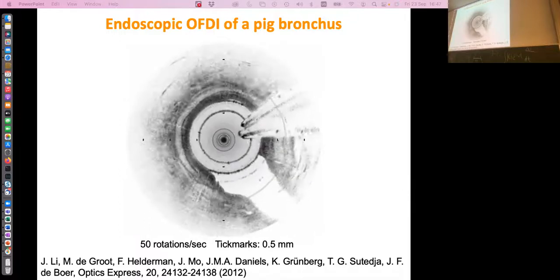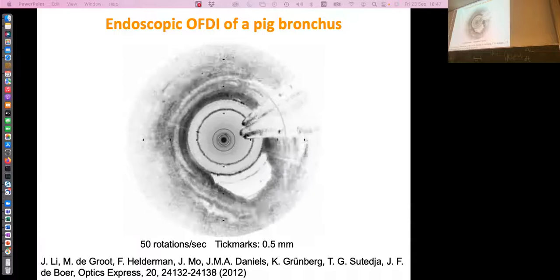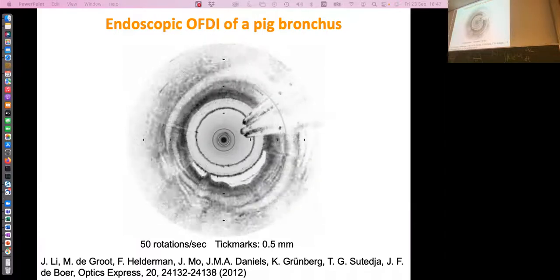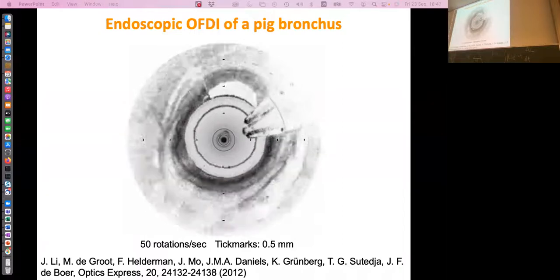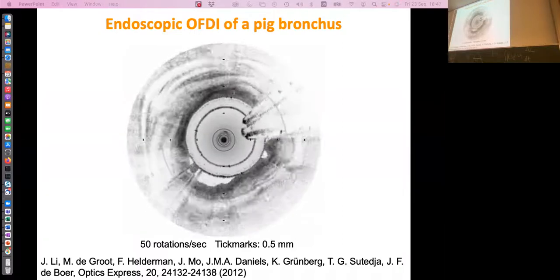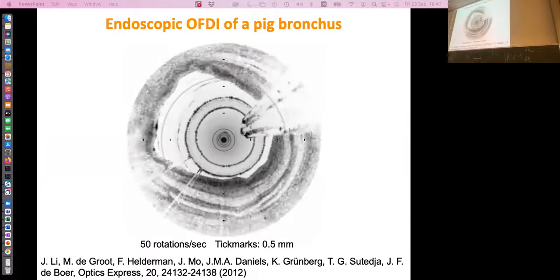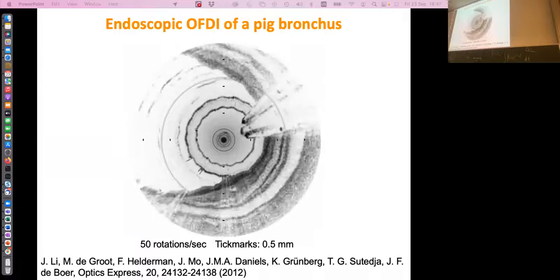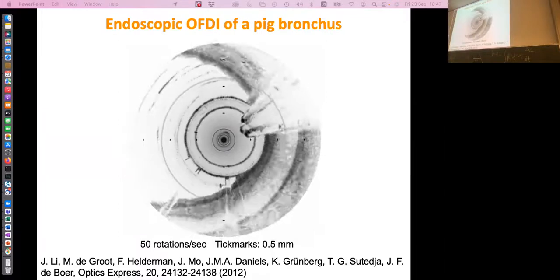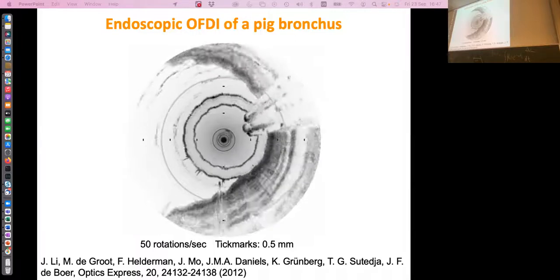And you can do several monoclonals. You can, for instance, take the medication against the tumor, give the patient a small dose, and then check if the medication ends up at the site of the tumor. And you know if that's not the case, it's not good. So PET is the only molecularly sensitive imaging. So if you can attach a radio tracer to it, you can attach a fluorophore.